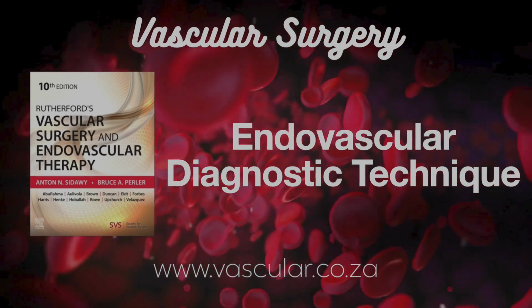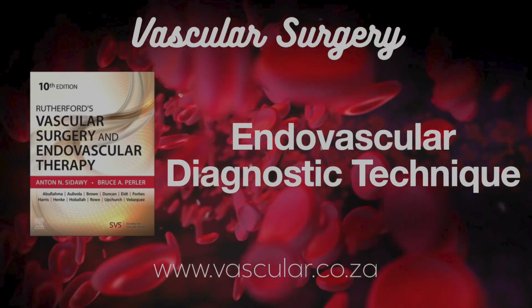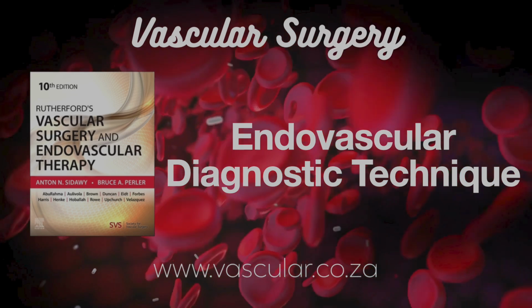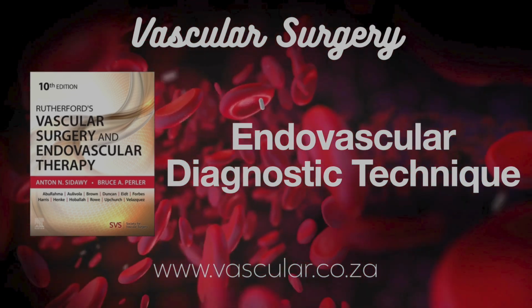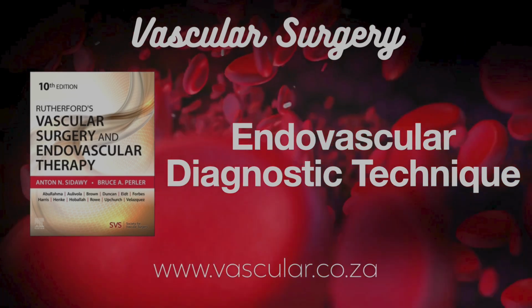Interesting. Okay, so we've hit the main two. What about some of those other arterial options you touched on? Popliteal, behind the knee. Yeah, the popliteal artery, you can access it retrograde, going backwards up the leg. Used to be done sometimes to cross an SFA blockage. But not so much anymore.